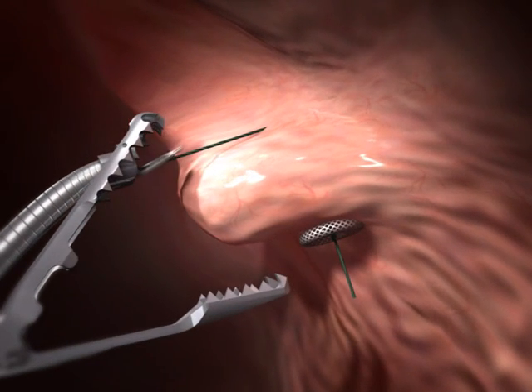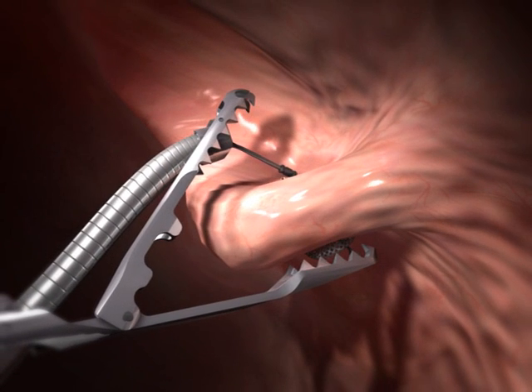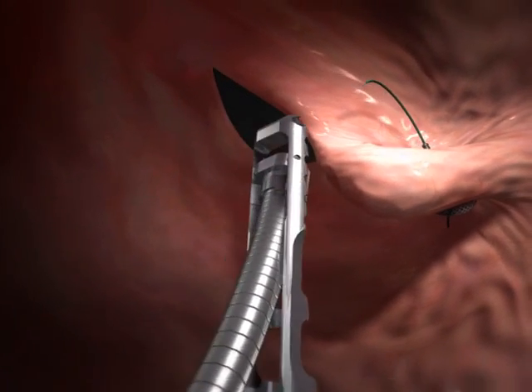To maintain durability of the folds, the suture anchors penetrate the muscularis or serosal layers of the stomach wall, and the large surface area covered by the anchors helps spread the holding forces on the tissue.